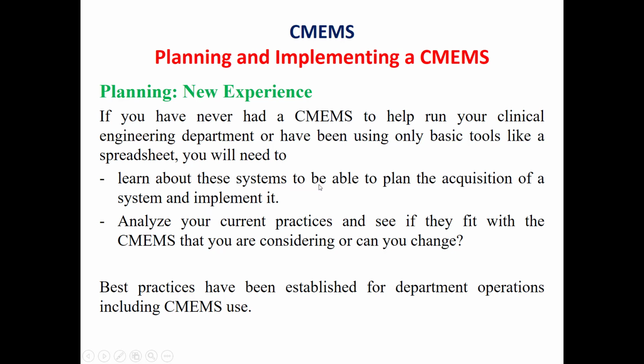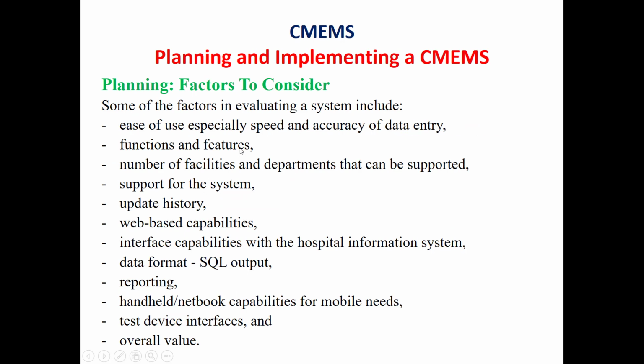should learn about this system to be able to plan the acquisition of the computerized medical equipment management system and to implement it effectively. Also, we should analyze the current practices of this clinical engineering department and see if they fit with the computerized medical equipment management system. What are the factors we should consider when planning for the acquisition of computerized medical equipment management systems?